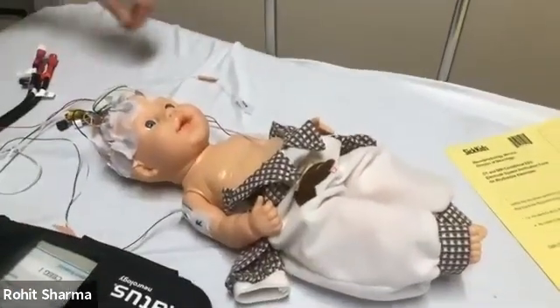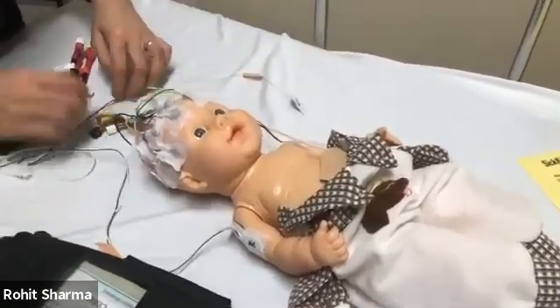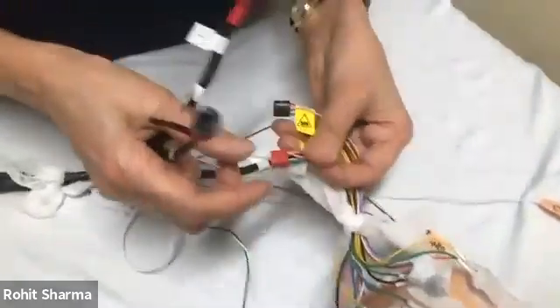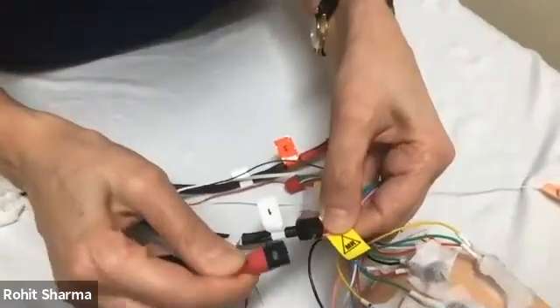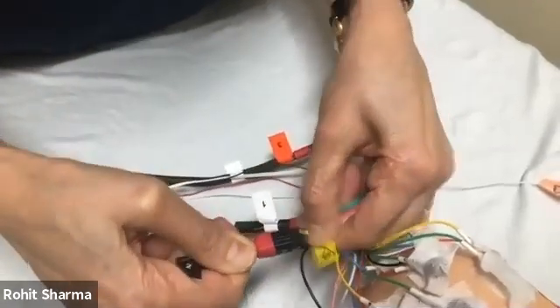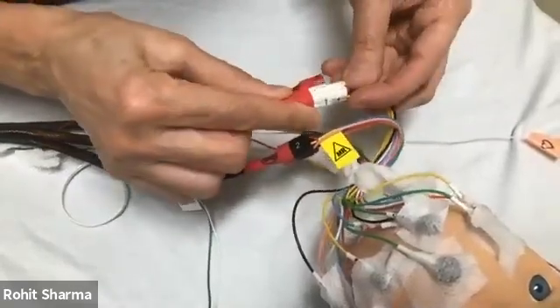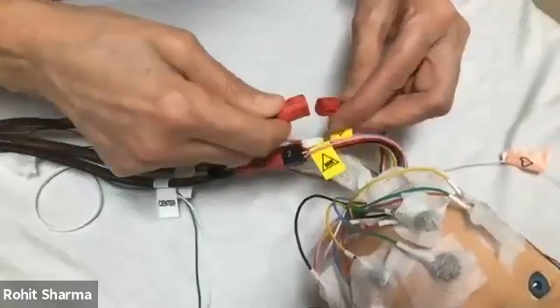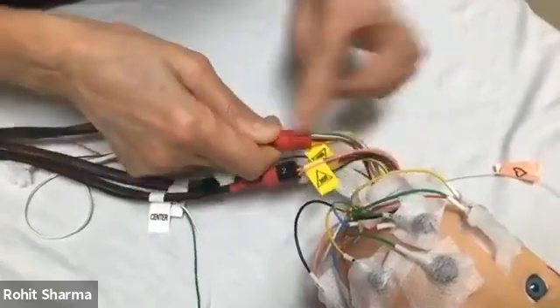So when you come back from CT and MRI, you just plug the machine, go back to machine, say back from CT. You can plug the tail end first. What we're gonna do is we're just gonna match the numbers. So this is number 2. So if you notice there's a little groove here, so plug there's number 2. We'll plug number 1, and then we can plug number 3. So number 3 is a little groove.